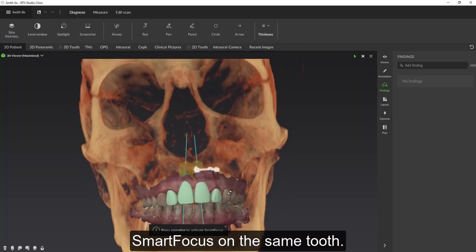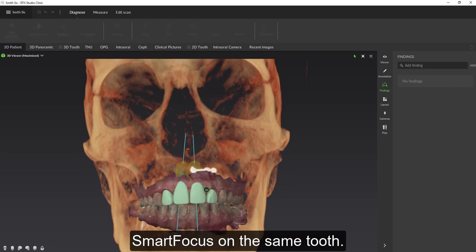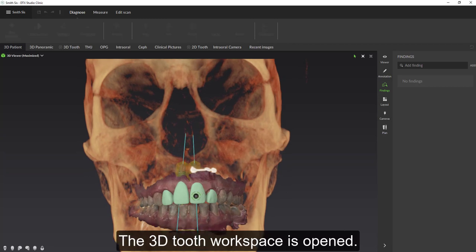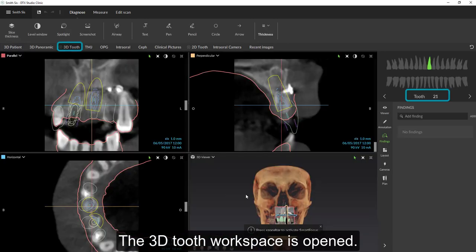Use Smart Focus on the same tooth. Then the 3D tooth workspace for this tooth is opened.